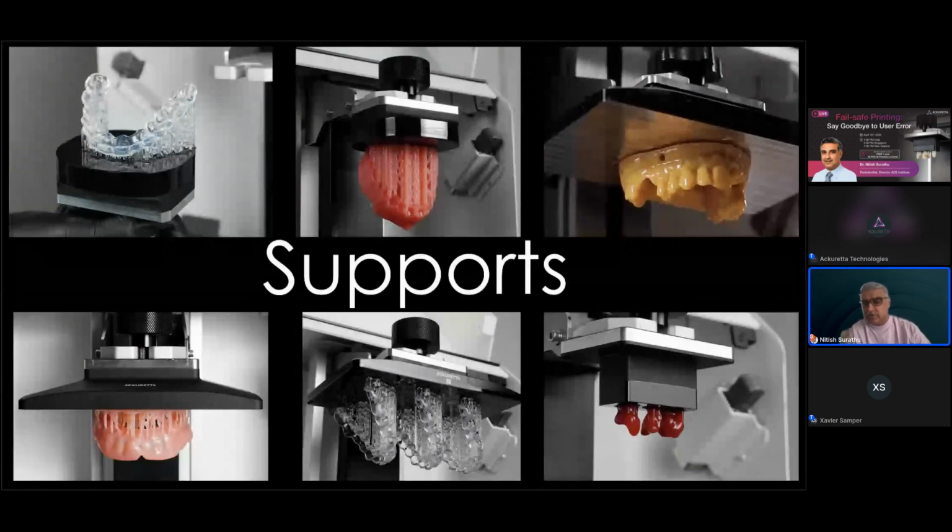On the lower right, you see castable resin, CuroCast, ProCast, and those are for castable crowns on a small platform. Notice how few supports there are on that particular print. So if you look at the upper right corner, though, that's supportless printing, which is very fashionable against expert users. But notice very carefully that the print has what we call a drain hole. I don't really appreciate the location of that drain hole.